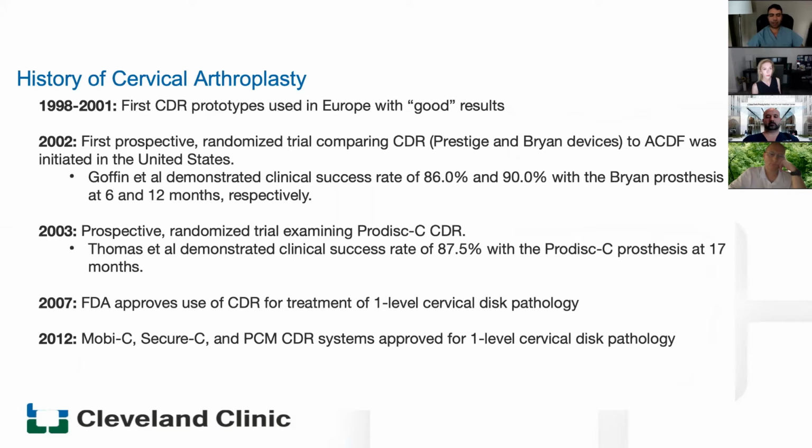There's a lot, again, heterogeneity in the studies. The authors defined, they weren't using standardized outcome scales, the typical limitations. But it was enough evidence there to show that maybe there's a signal in this data. And that launched many, many more trials that came out, looking at basically proof of concept type studies, just showing that these things work, these patients do well. And there's many, many of these as we went all along throughout the 2000s.